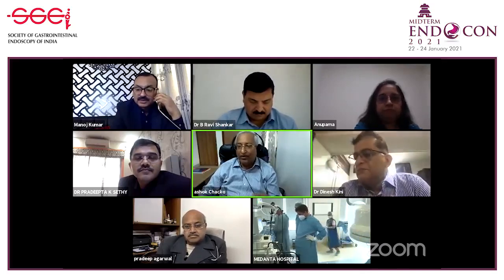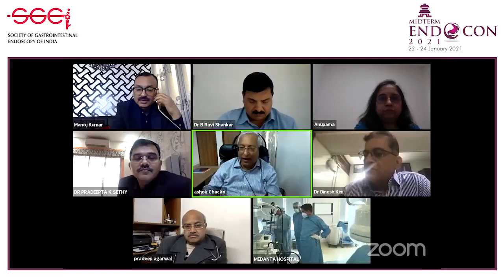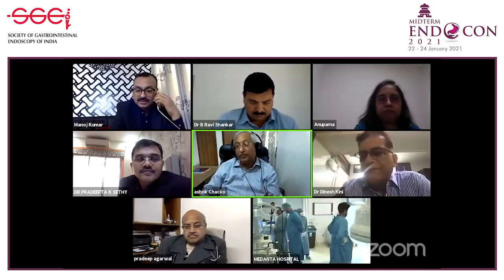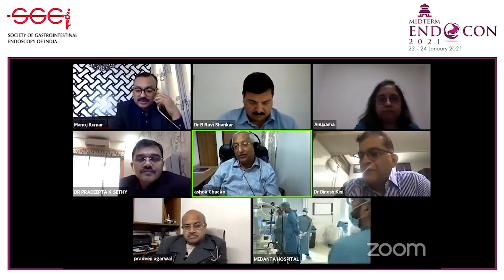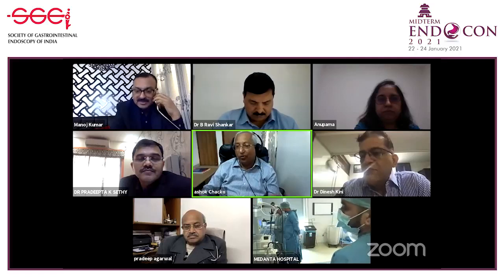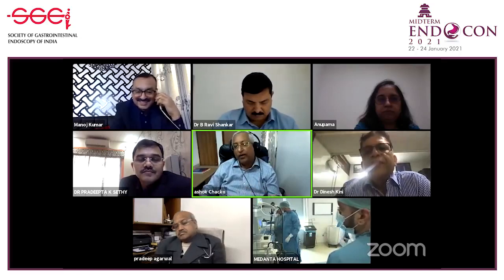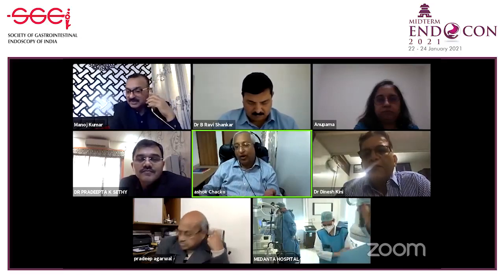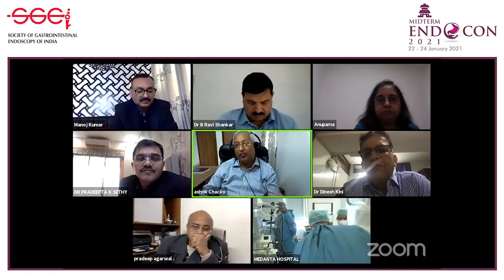I think once the capsule gets retained, normally it comes out within 48 hours or 72 hours. But if you suspect it is still there, the patient hasn't seen it in the stool, then you can fluoroscope, and usually we'll be able to detect the capsule. We don't have to panic, because what I normally do is give them laxatives, try to give them prokinetics as well as some PEG.